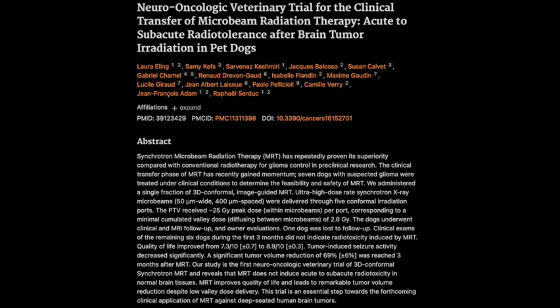So they help pinpoint the tumor's exact location in real time during the treatment. Exactly. The imaging system tracks these markers and adjusts the radiation beams accordingly, ensuring the tumor remains the target, even with minor movement. It's mind-boggling how they can control something so powerful at such a microscopic scale. It is. But this precision is not just about the technology, it's about protecting the healthy brain tissues surrounding the tumor. Absolutely. And that brings us to another fascinating aspect of MRT.